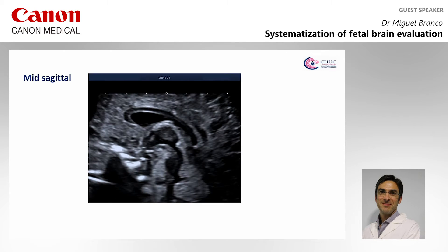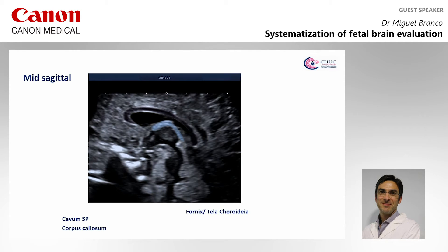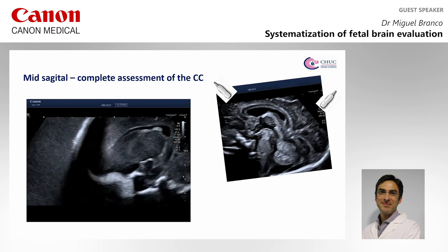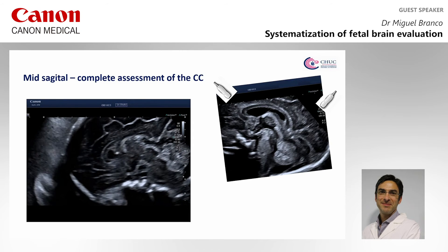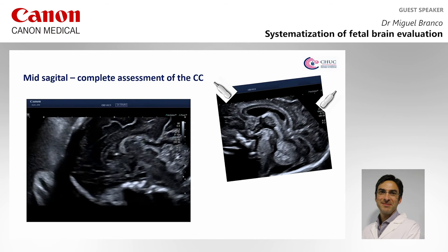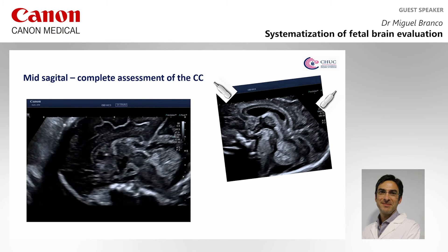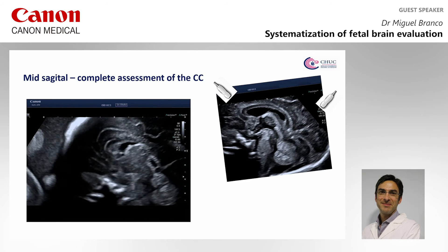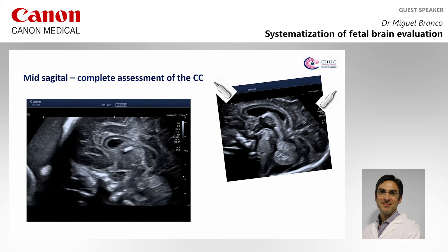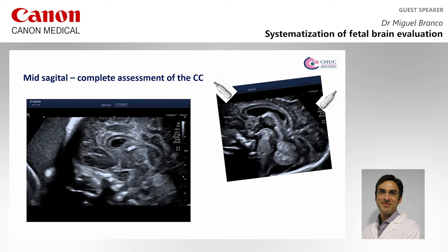In the mid-sagittal plane, we can identify the cavum septi pellucidi, the corpus callosum, the tela choroidea, the third ventricle, and the interthalamic adhesion. If we move the transducer from the anterior fontanella to the posterior fontanella, we will obtain better resolution of the rostrum and the splenium of the corpus callosum.